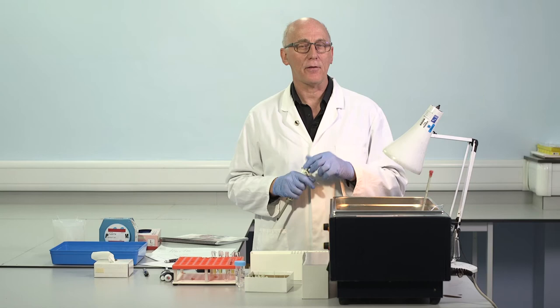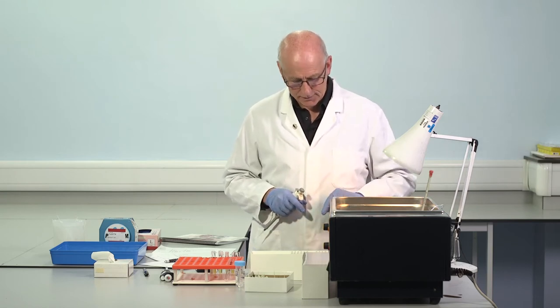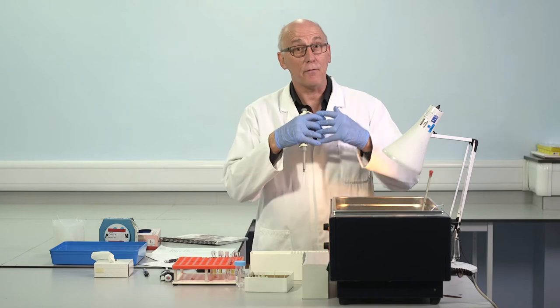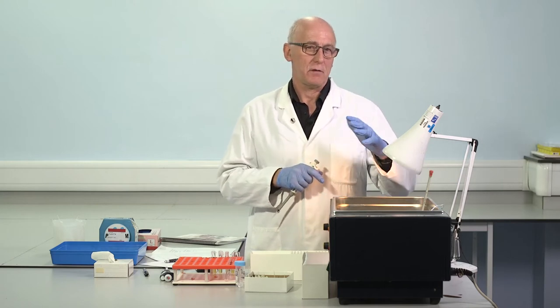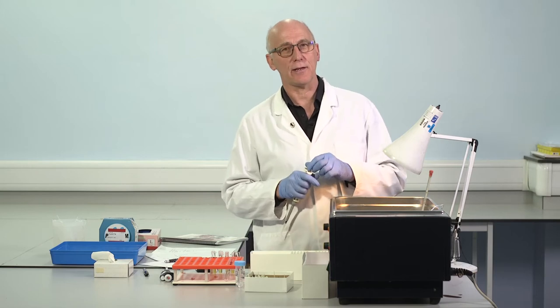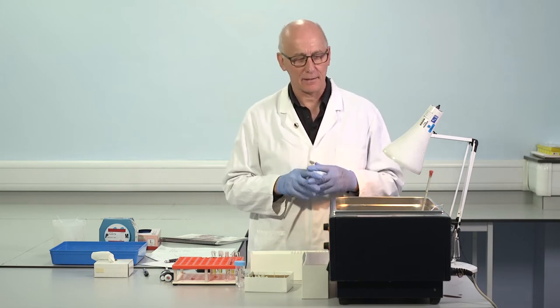It's often in the upper part of the reference range, and I think that's an important area. This particular control that we're using, we've prepared in such a way that it sits a little bit above the upper limit of the normal range for this reagent. So normal control, not quite. Actually, it's a mildly prolonged abnormal control. We have also a grossly prolonged abnormal control. So I think it's an important area. So we need to think about this a little bit.